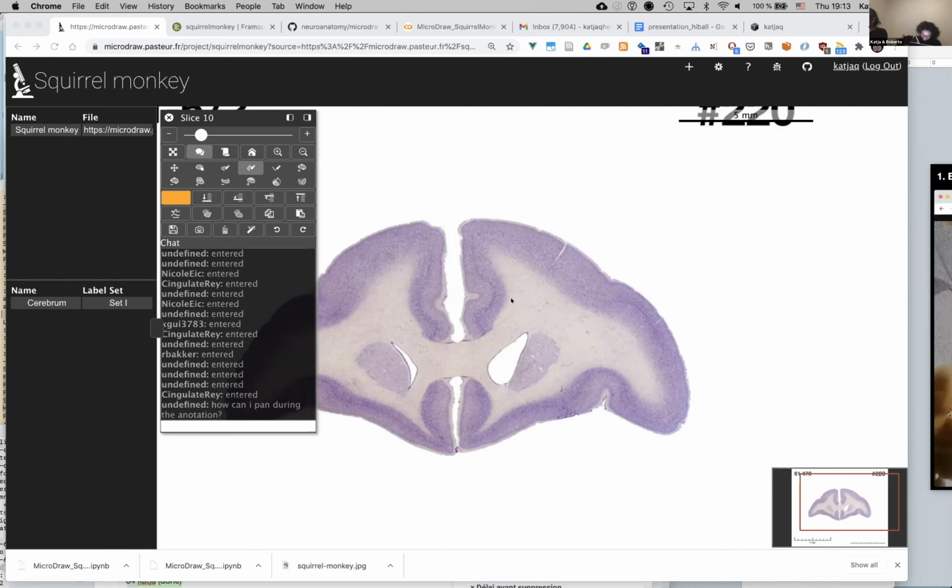Let's check what time it is. It's 7:13. We say 10 more minutes. Yes, we do 10 minutes of segmentation. Let's see how much we manage to get done.